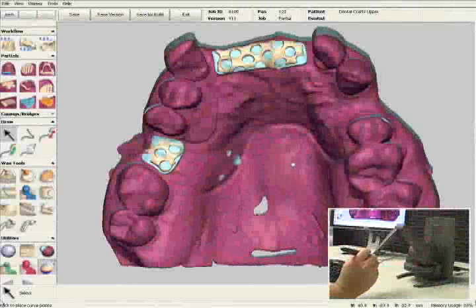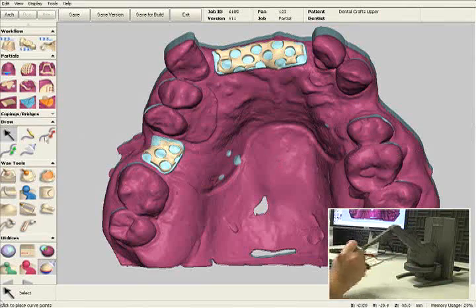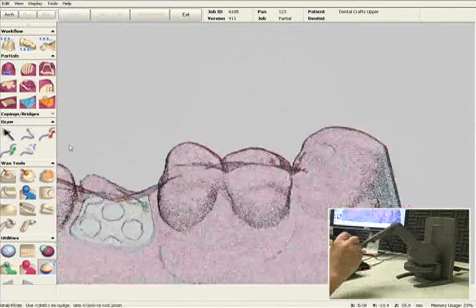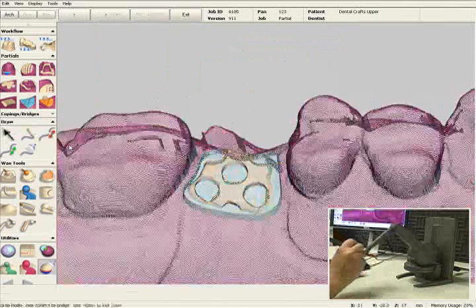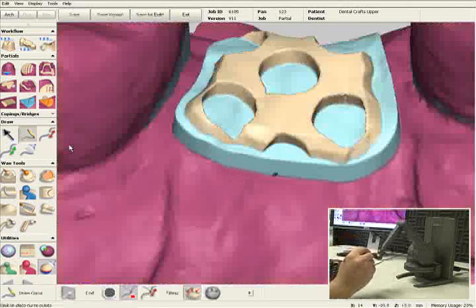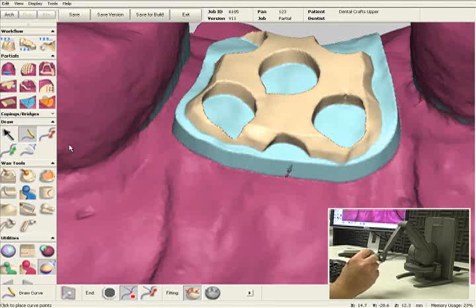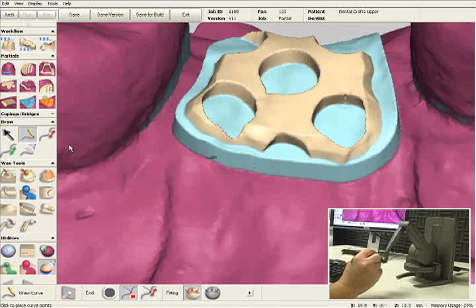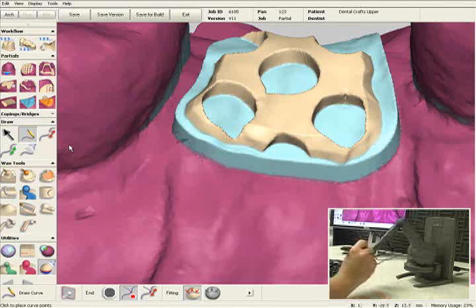Now we'll design the major connector and the finish line. I'm going to start by selecting the pencil tool and rotate this model so I can see the mesh area a little bit better. There's a sharp edge right here where the relief wax and the tissue area meet. With my pencil tool, I can actually feel that edge. So I'm going to start designing my major connector right up against the relief wax.